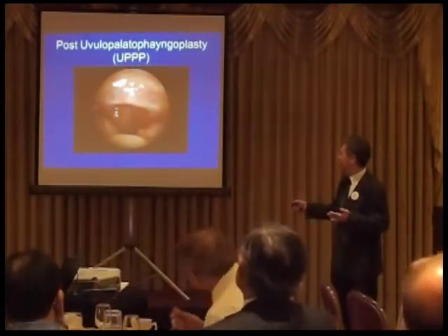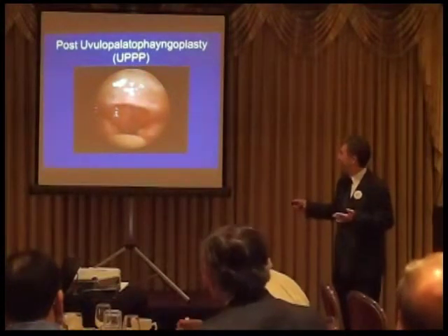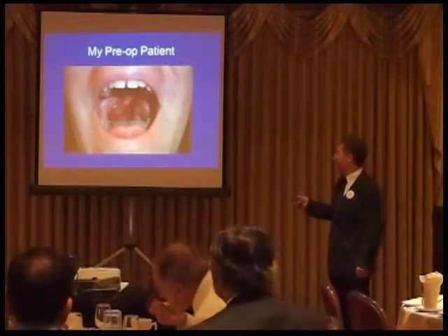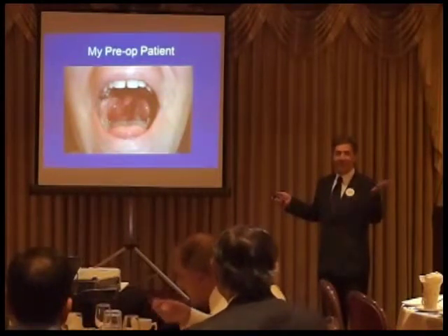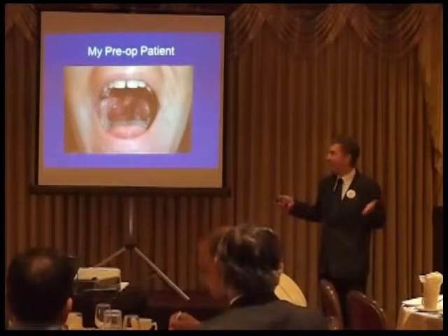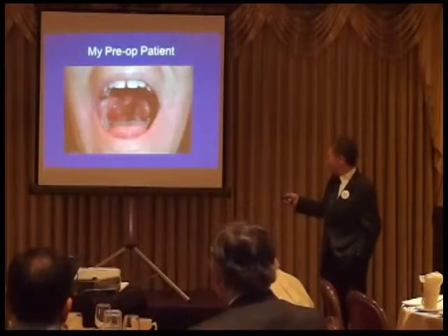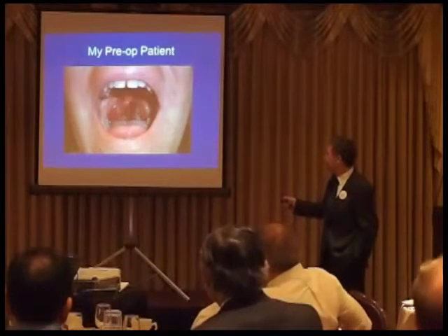The uvula goes with this. This is like opening up, for a patient that had bad sleep apnea and snoring. But this is a patient of mine, a very sensitive patient that came because now it's on the internet. There are YouTube videos of people getting these tonsillectomies done. So they call the company up and ask, who does this tonsillectomy? So this guy came from about 15 minutes away, from a different suburb, and he showed me how bad his tonsils were, how inflamed.